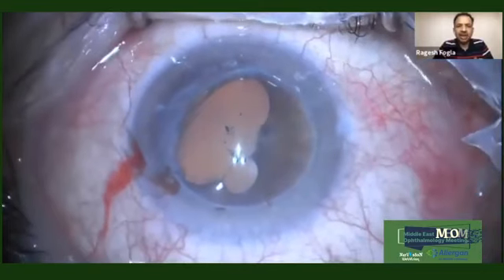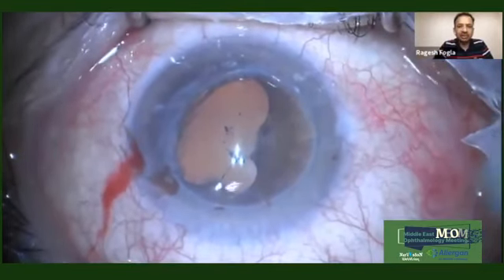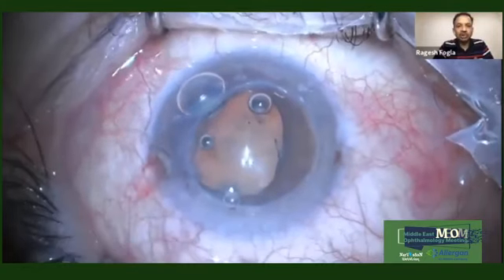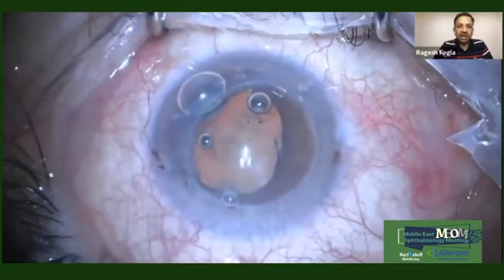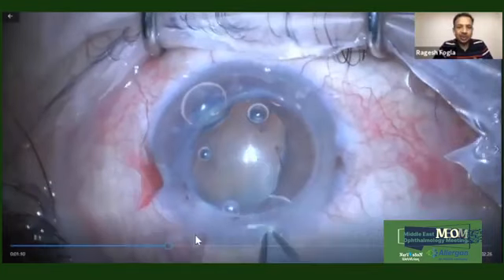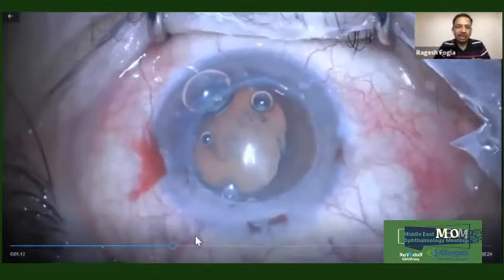No, ideally, yes, if the cataract can wait, and if the other eye's vision is good, we can do a suture removal and wait a few weeks for stabilization of the surface. If not, then I would remove the sutures, see the patient the following day, and try to assess what kind of values my cornea shows.